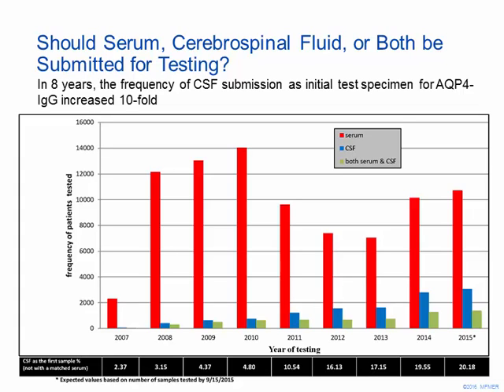It's important to note, however, that we currently do not know whether or not titer is clinically relevant. We certainly do see titers commonly drop in the setting of immunosuppression. And some data suggests that titers of antibodies will rise before an attack. But this really requires confirmation with some larger studies that are currently underway at Mayo Clinic.